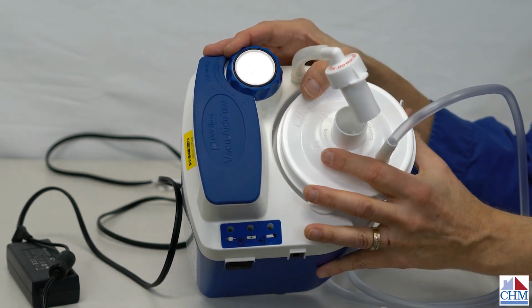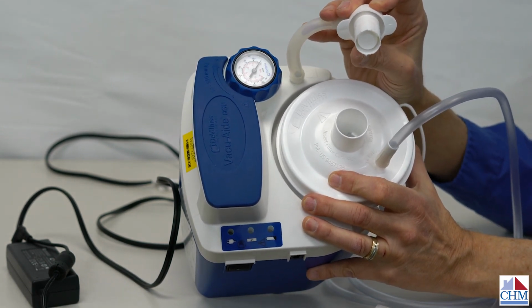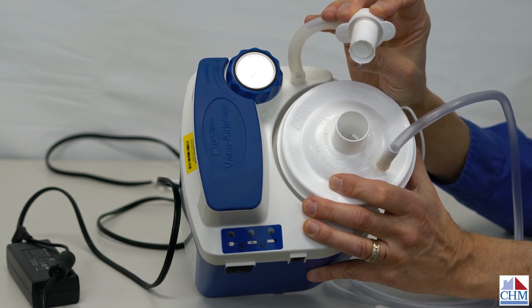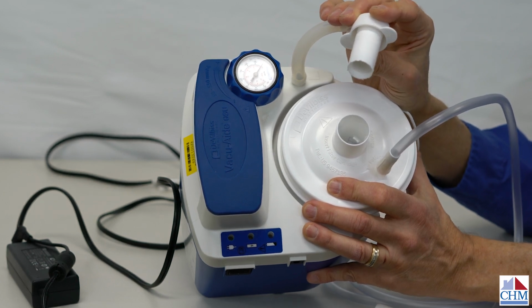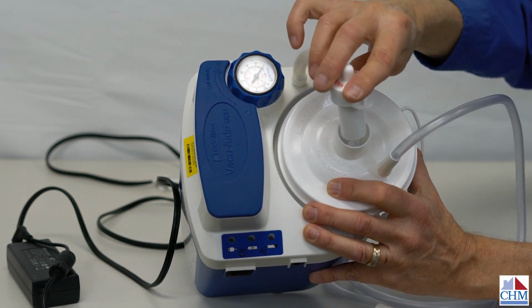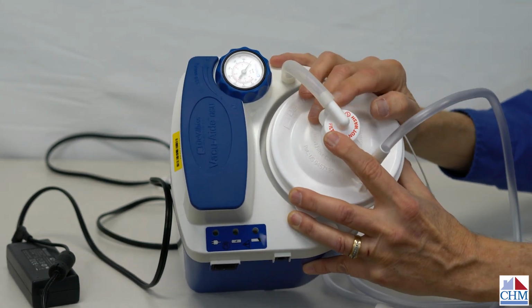So this is a real important point. Because that's a filter, if that filter gets wet, it will occlude airflow. So if it's wet, say you wash the canister or accidentally splashed water into it or something, because it swells up, it stops airflow. So make sure that that filter stays dry at all times.